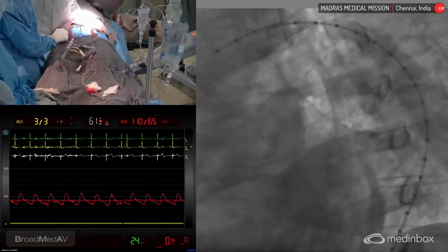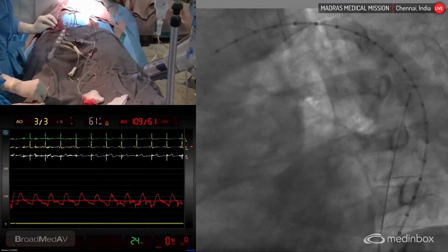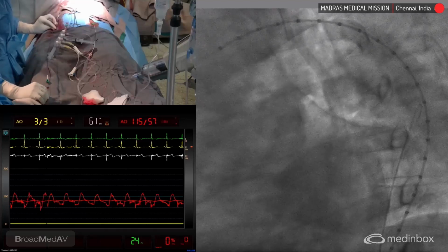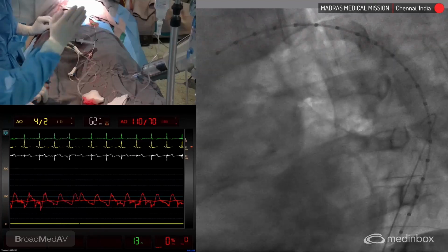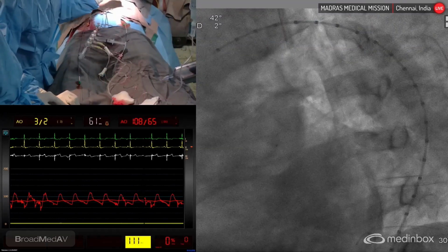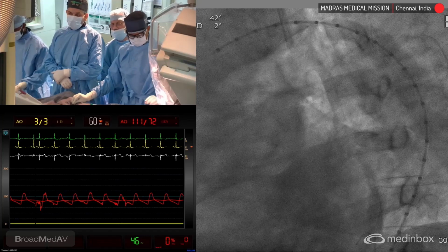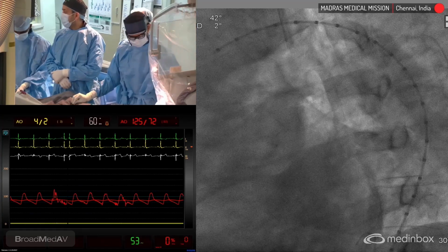So how do you oversize generally in aneurysm or dissection? In aneurysm, we can oversize by 20 to 30%, whereas for dissections, we oversize only by 10%. So for aneurysm, you oversize by 3 to 4 millimeter over the diameter, and for dissections you oversize by 1 millimeter.